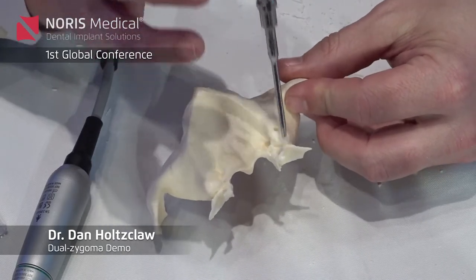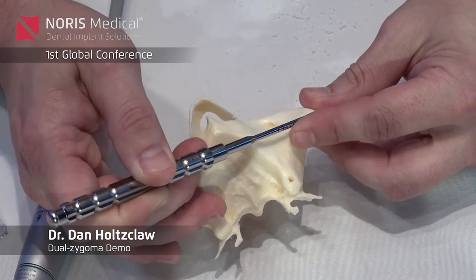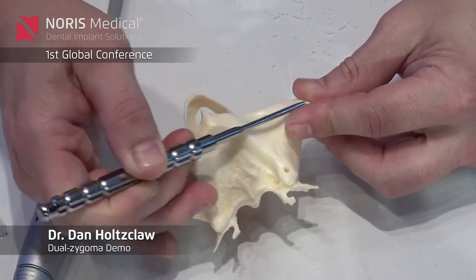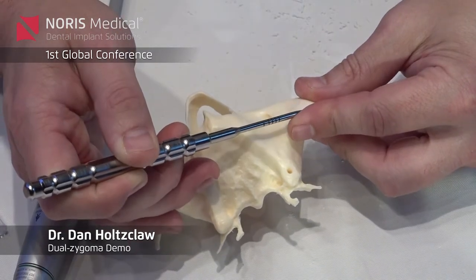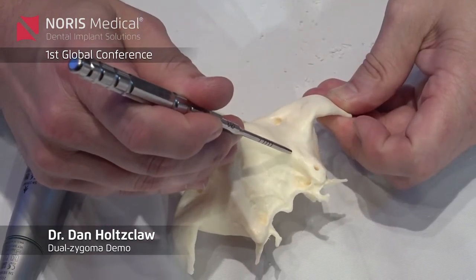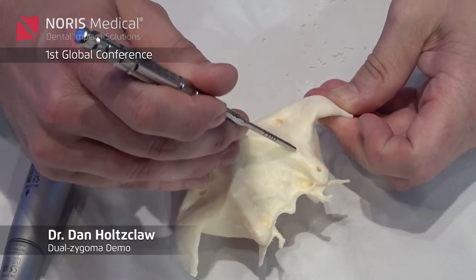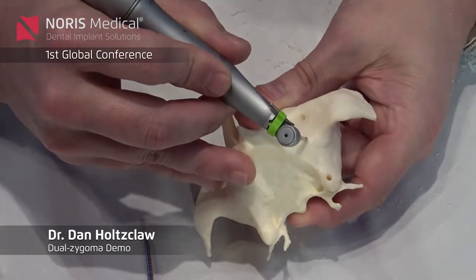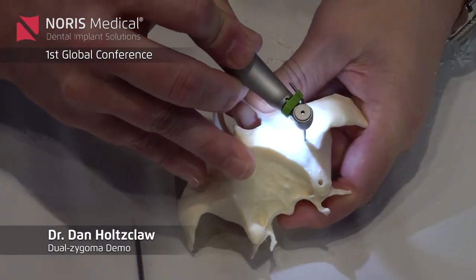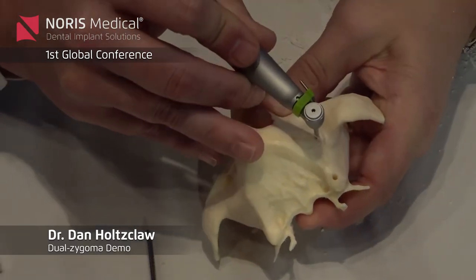That way, if I have a very strong pterygoid, I know I could come maybe a little bit more anterior. The more anterior I come, the safer I am away from the orbit. What I'm looking at is usually about the second premolar area on average for the exit point. If you go too low — say you drill in on this model — you'll see how you pop into the sinus.